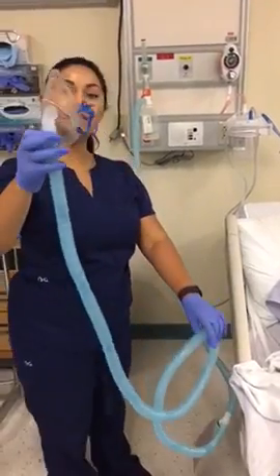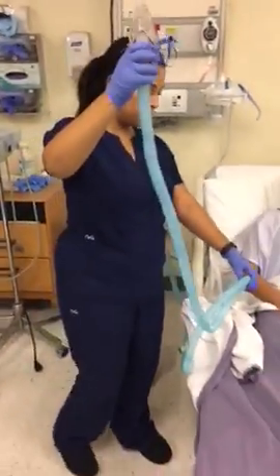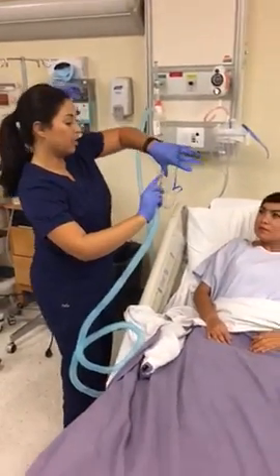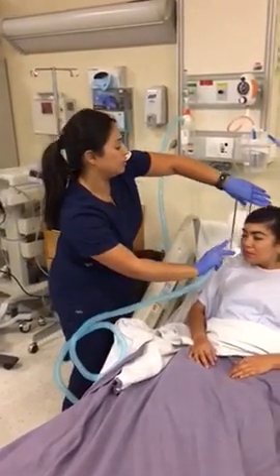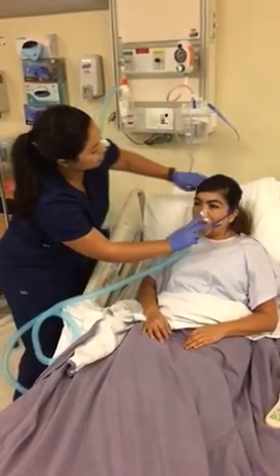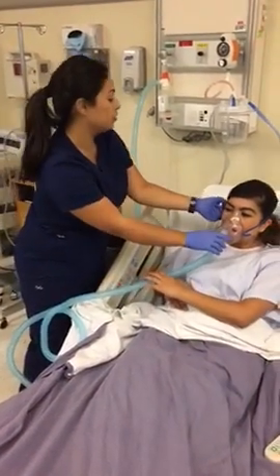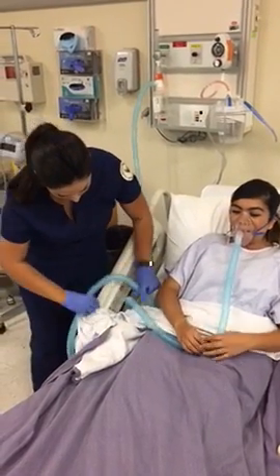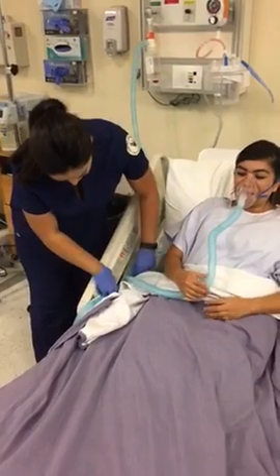Alright, Mrs. Islas, I'm going to go ahead and put on your mask now. Again, this should have you feeling a lot better. I'm going to put it on, just ask you to raise your head. Thank you so much. How does that feel? Oh, it's good. Not in your eye or irritating your ear or anything? No. It's good? Okay. Let me get some of this tubing out of your way.